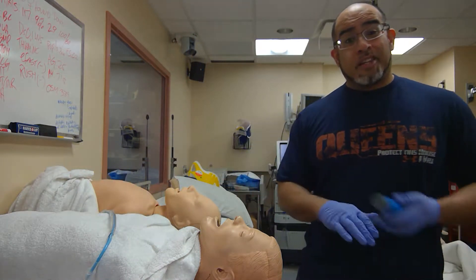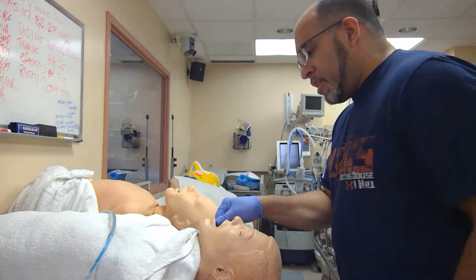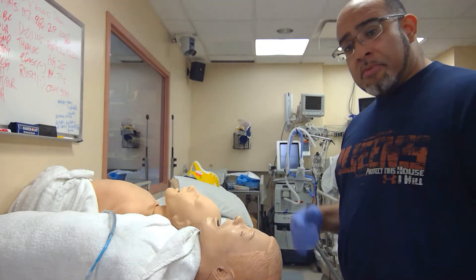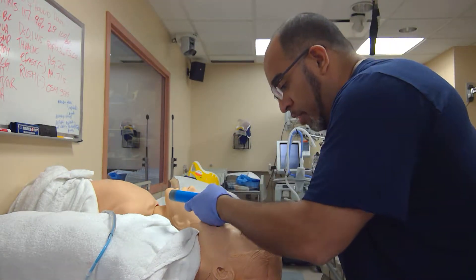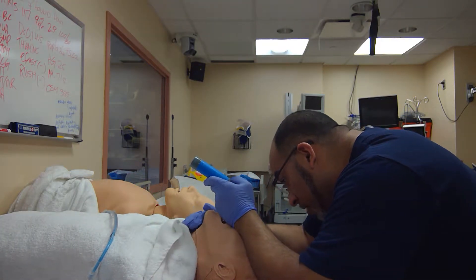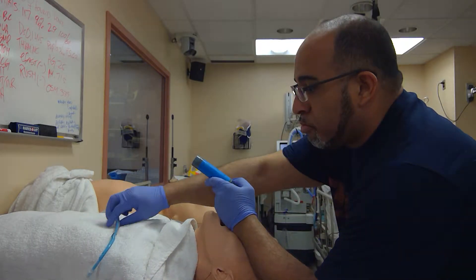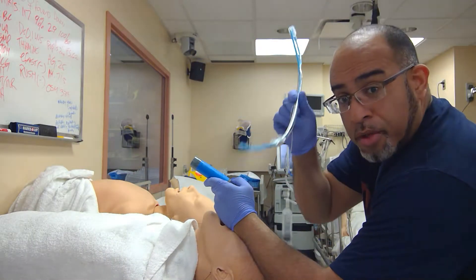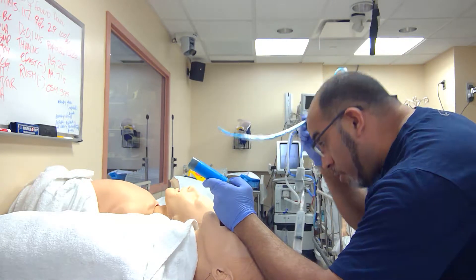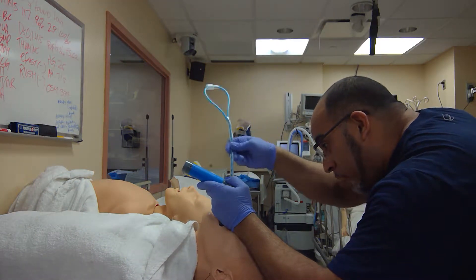The hard part is someone handing it to you and then you lose your grip. Intubator standard. I just inherited this airway from someone else who had the patient in a certain position, so I'm going to be stuck in this position. Go in, visualize the laryngoscopy, realize I have a MAC blade. Visualizing — see the cords. If someone hands it to me, keep my hand still, not wibbly wobbly. Do my best to avoid the blade; the blade will deflect away. Angle my tip in.